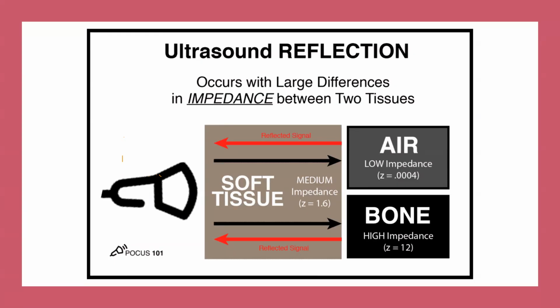When you come to the ventricular system, that's fluid. And we know that fluid, from your perspective, again, there's a slight difference in impedance between the ventricular lining and fluid. So the ventricular lining has a higher acoustic impedance as compared to fluid, and hence the change causes more reflection.